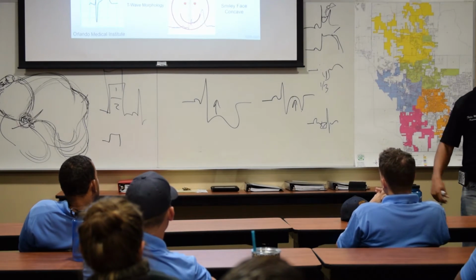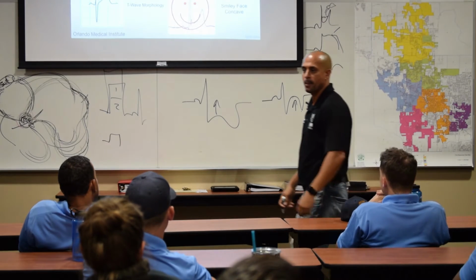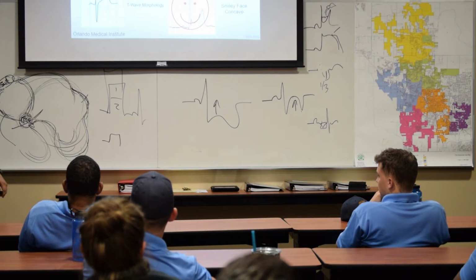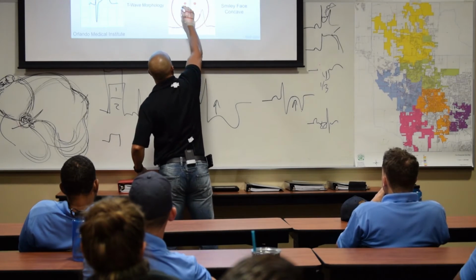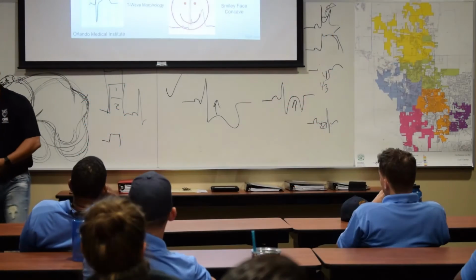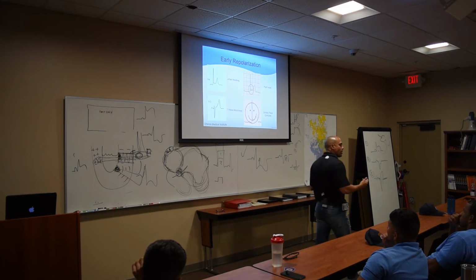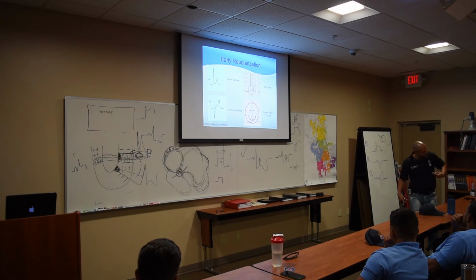You with me? And if I'm not certain, what am I looking for? To confirm, reciprocal changes. Where? Opposite side. Or you could draw a happy face. Yup, concave. You could see the fish hook on top. Those are just different things you can look for in early repo. You know where you're going to see these? Who's repolarizing early? Your ventricles. So what leads look at the ventricles? These right here.